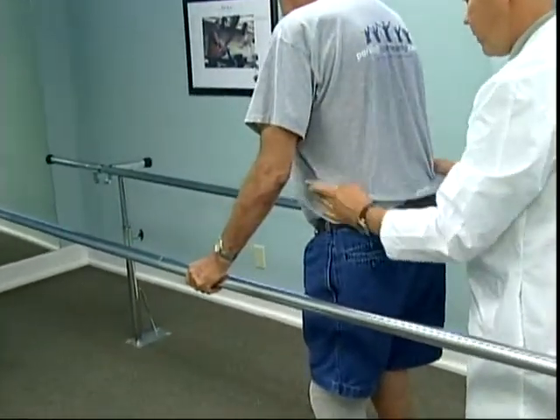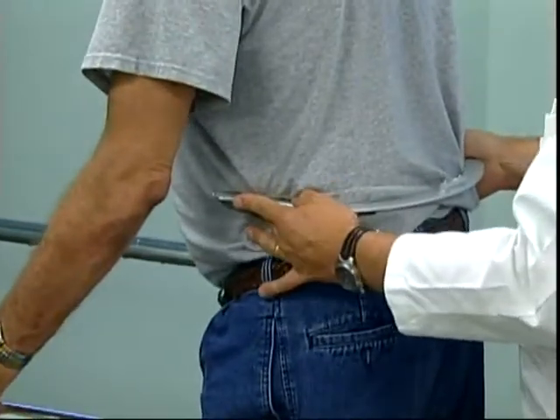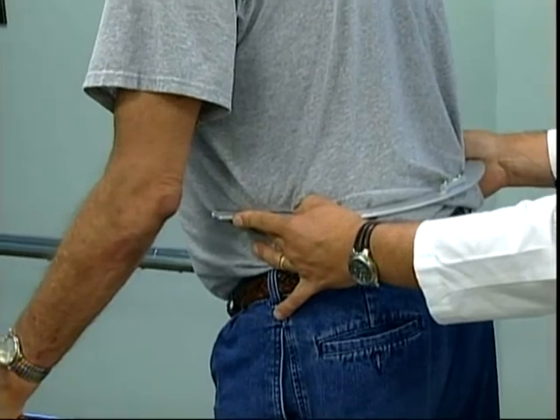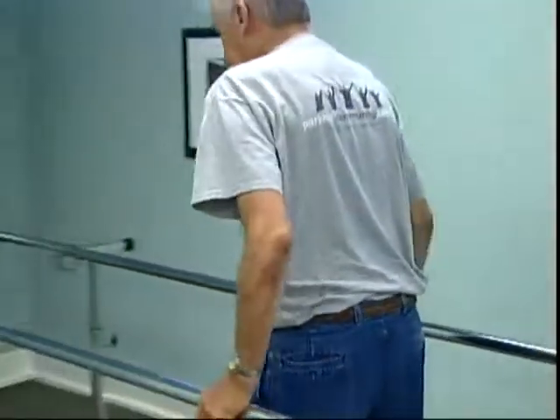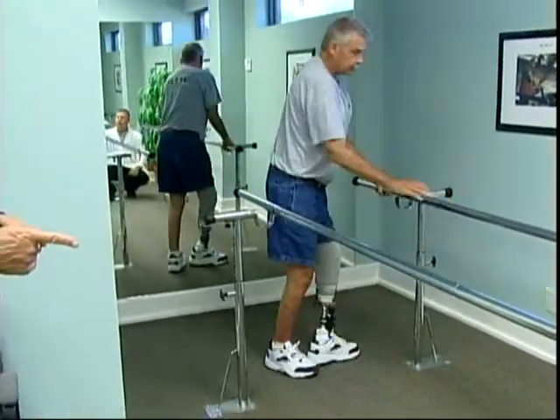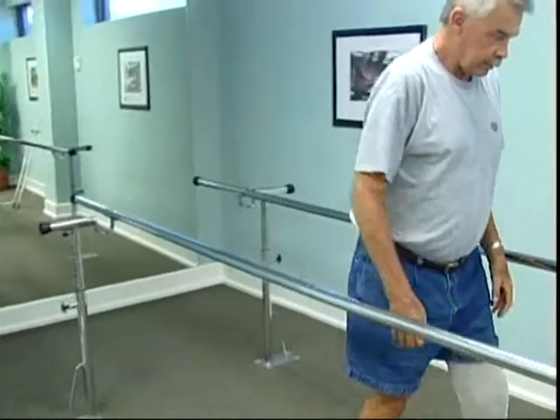I'm going to get on your pelvis here. Make sure we're level. I've got a pelvic level. Make sure the pelvis is level. We've got that. We're good, and we can keep going. Okay, so we can walk some more. So if one leg was a little longer than the other, then that bubble wouldn't be in the middle. That's correct. It would show me that, and we'd make an adjustment either higher or lower as needed.